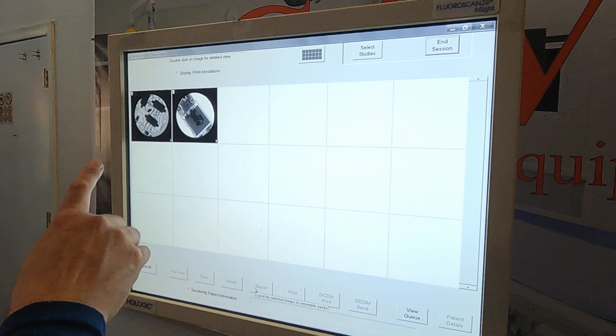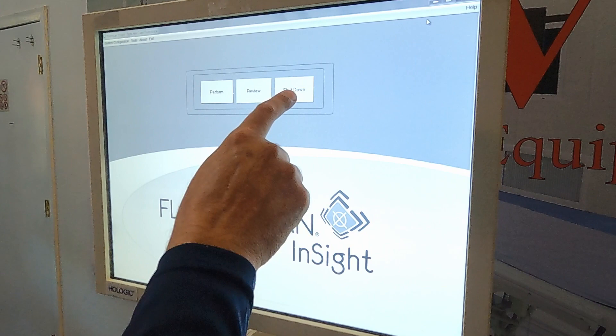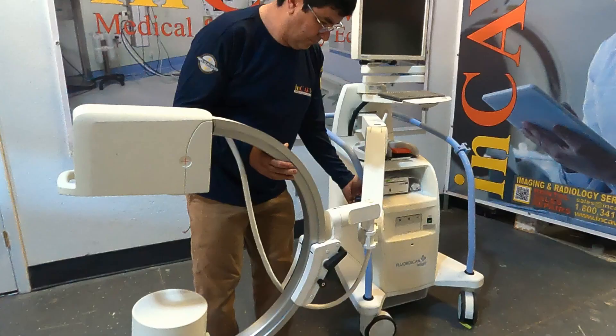We can search any patient and see again all the images we saved. To exit, just click on end session and go back to the home screen. To shut down, just click shut down and in a few seconds the Mini-C will turn off.